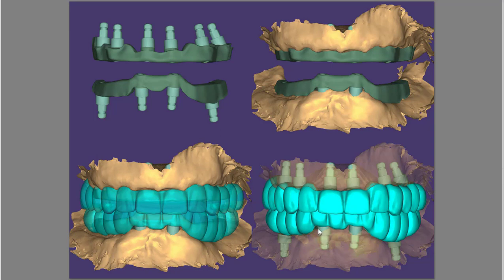We won't be able to make custom abutments on these two implants. We're doing a PMMA bar-supported overdenture, and it's very difficult to mill into multi-unit abutments down here over custom abutments. So we wouldn't be able to do custom abutments on these two with a bar and PMMA on top. But you can see how the bar has convexities into the soft tissue to try to recreate the soft tissue profile.